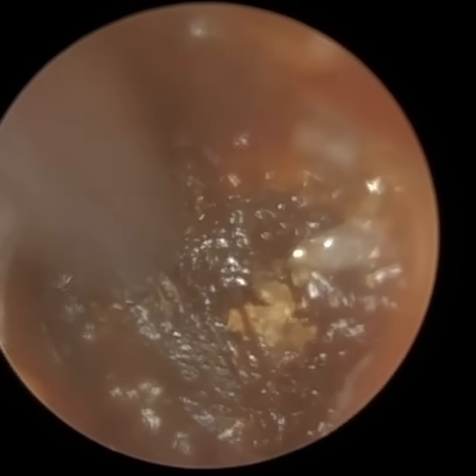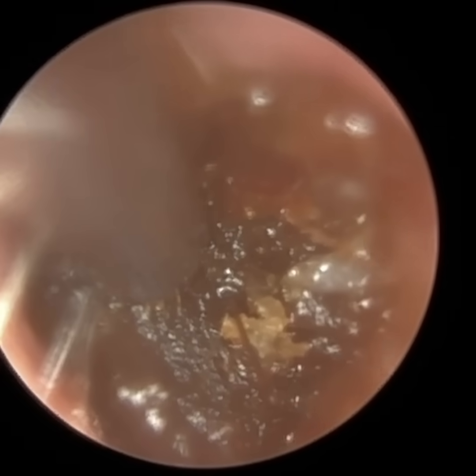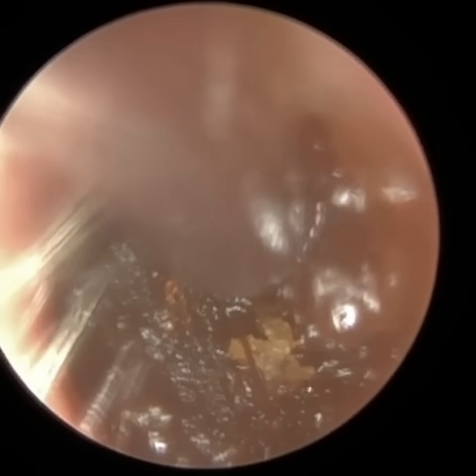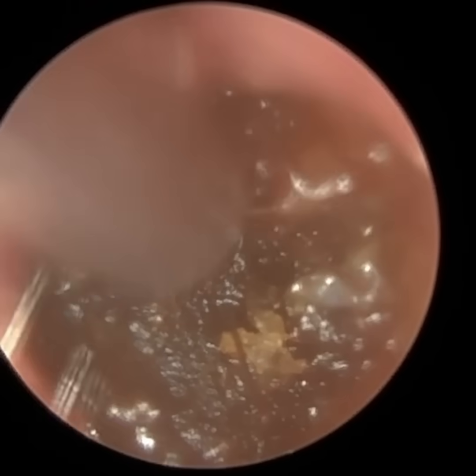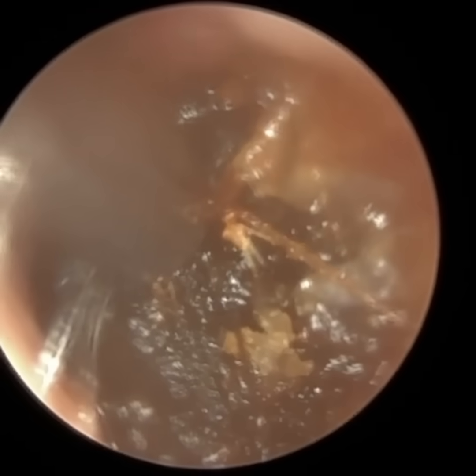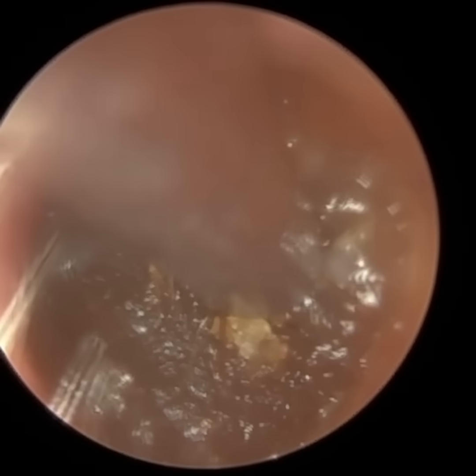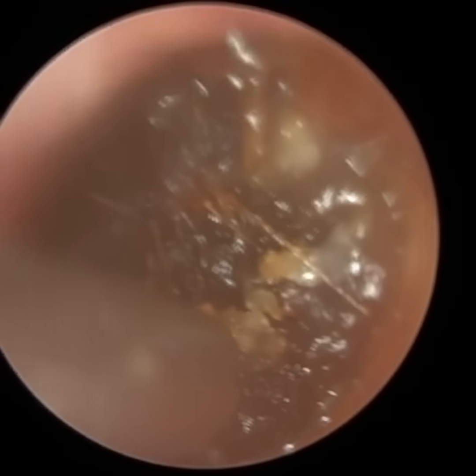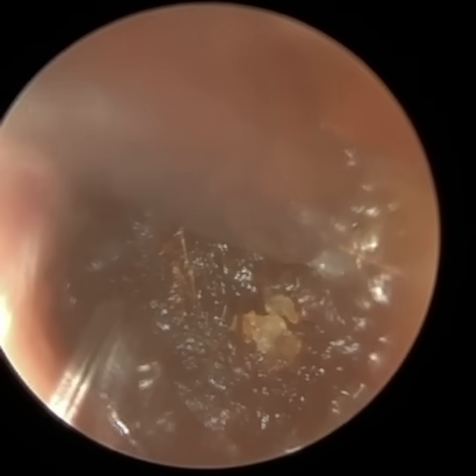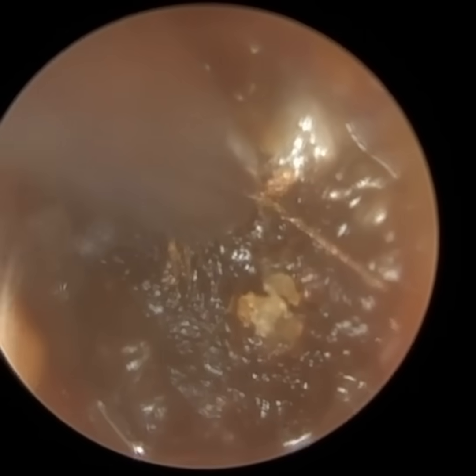So with the Birmingham gauge system, the lower the number, the bigger the suction tube. So 14 gauge is the suction tube that we typically use. You can call it a Zollner if you like. Then I've got the 15, 16, 17, 18 and 19. So I've even got a 19 gauge, which is smaller than what I'm using here, the 18 gauge. And we've also got our own suction handles where you attach the suction tips on to, so I can't wait until they're released.